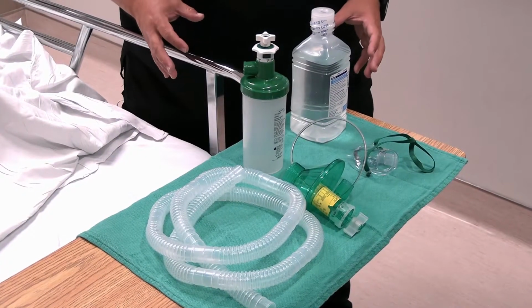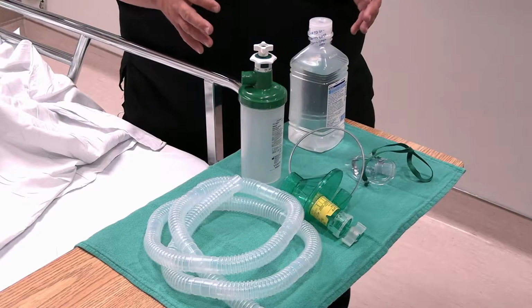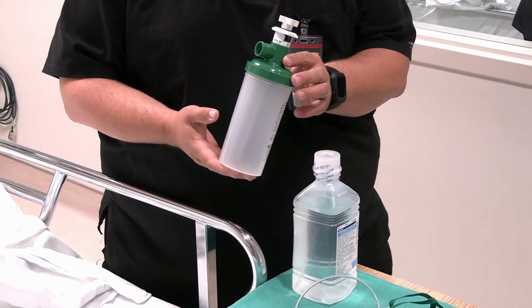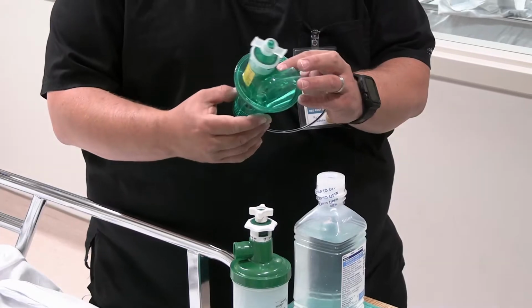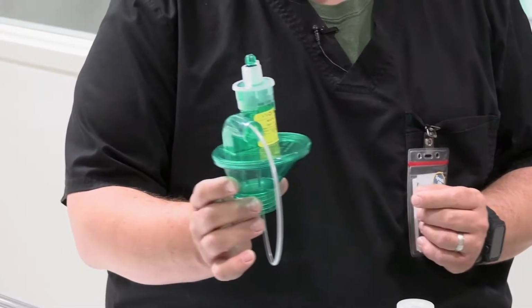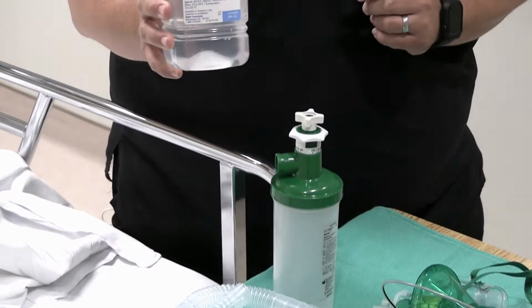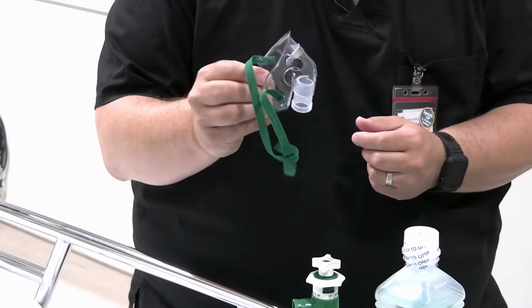So another device that you might have available to you are our large volume nebulizers for oxygen therapy. So we have two different types of large volume nebulizers here. Consider this like a low flow or 50% or below device here. And then if you need to use more than 50% FiO2, we recommend using the Heated Hi-Flow or high-ox large volume nebulizer. In addition to having those devices, you're going to need your corrugated tubing here, your sterile water for your nebulizers, and then an appropriately sized aerosol mask.